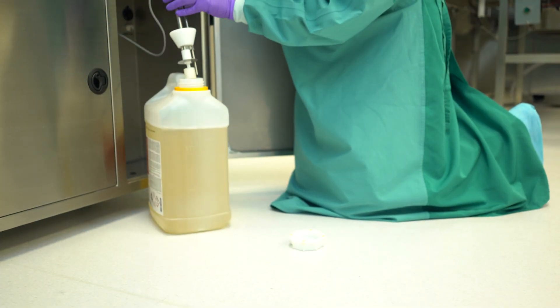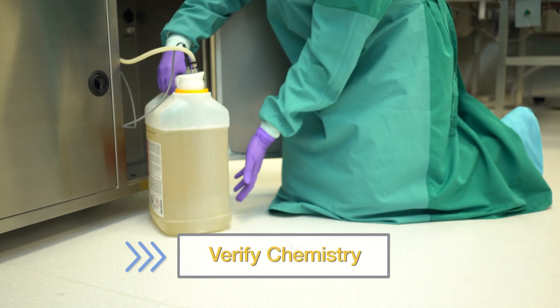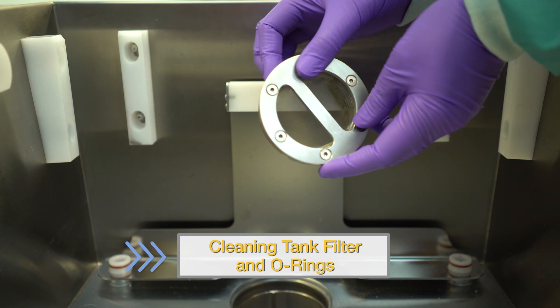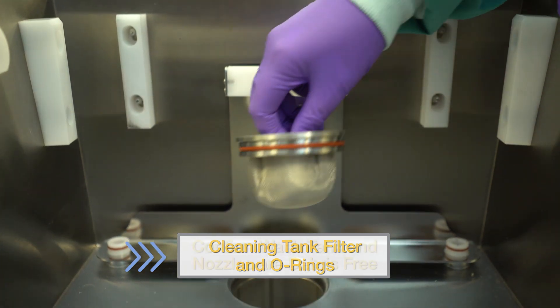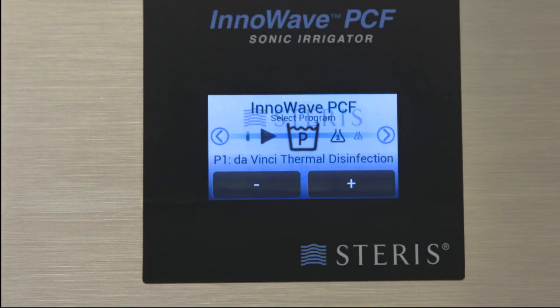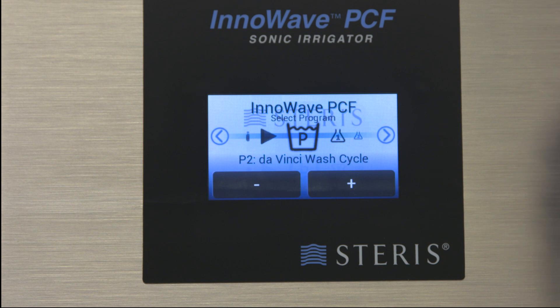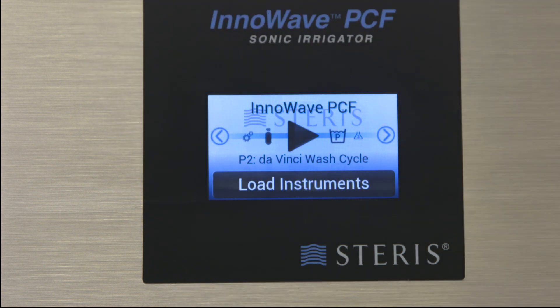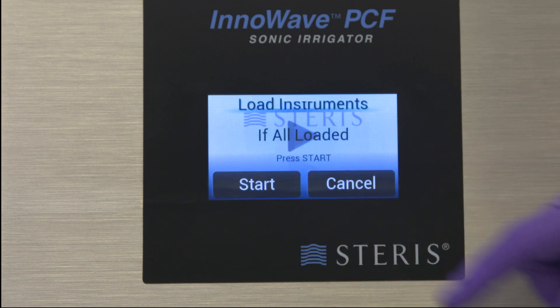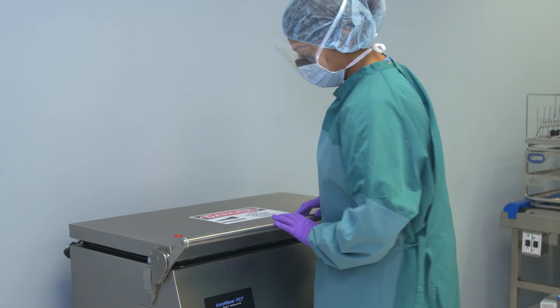The InnoWave PCF has 4 pre-programmed cycles and 3 spots for custom cycles. Before selecting and starting a cycle, complete all pre-cycle checks — this includes verifying enough chemistry is present for the next wash, inspecting and cleaning the tank filter and O-rings, and confirming the wash tank and spray nozzles are free from debris. Use the arrow keys to reach the wash menu and use the plus and minus buttons to scroll through until you reach the appropriate cycle. Then scroll back to the start icon, shift down the lid locking bar to close the unit, and select the start button to initiate the cycle.